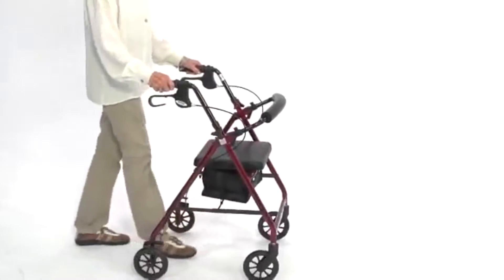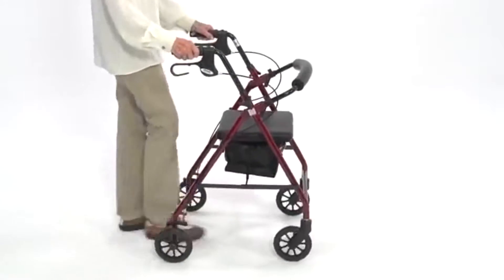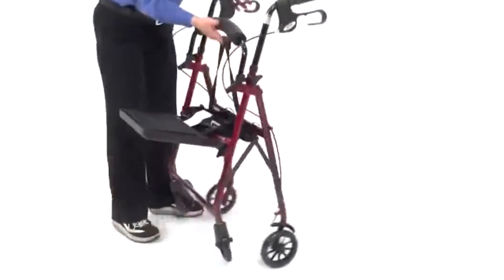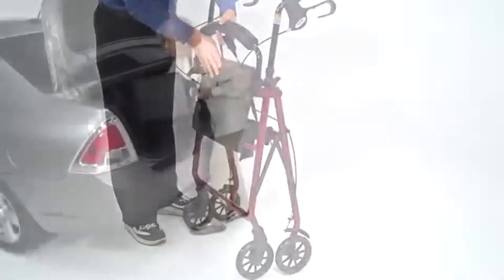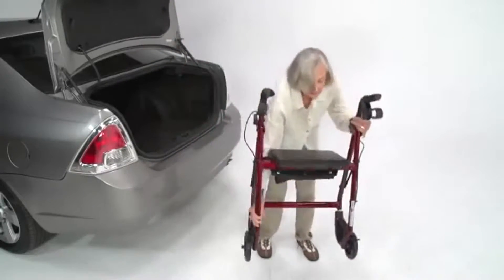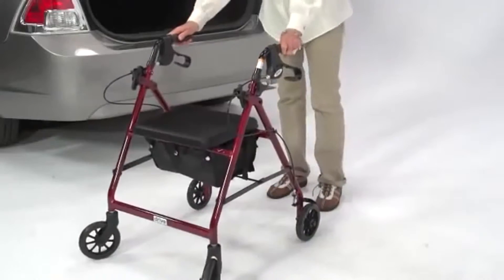This makes it a very transportable and convenient walking support that users can take with them wherever they go. The rollator's lightweight folding frame also makes it easier for the user or companion or caregiver to lift in and out of a vehicle or store it away.